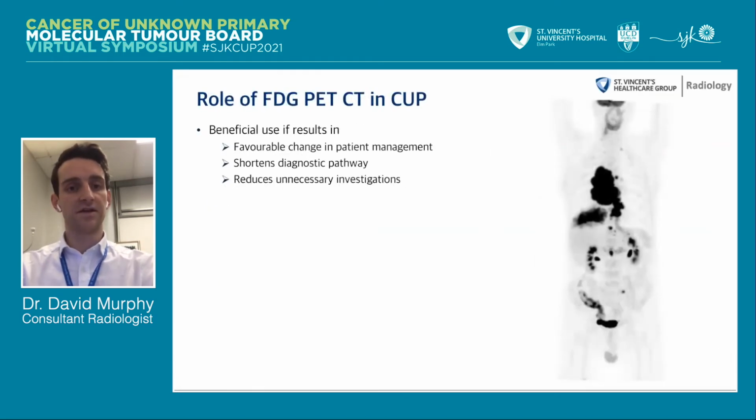So PET is beneficial if it can help change patient management, shorten the diagnostic pathway, and reduce unnecessary investigations. But it is not a panacea test. There are challenges for it. First of all, its availability can be quite limited. It's limited to just a few centres usually.